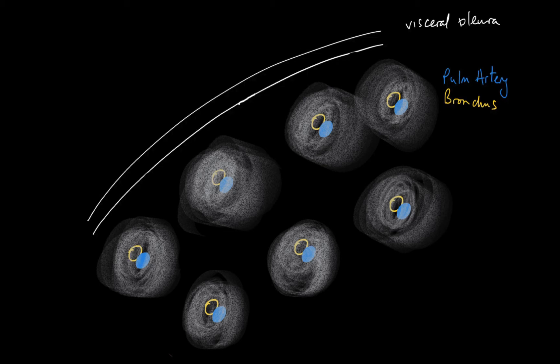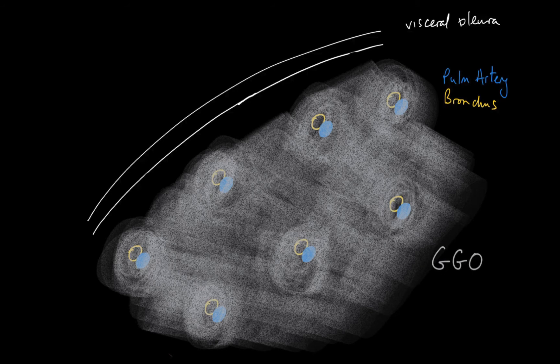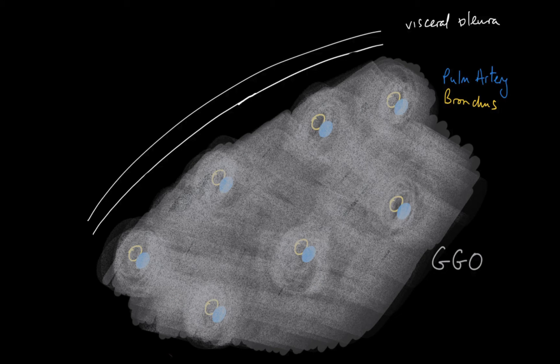As the central lobular nodules get bigger they start to become more ill-defined and start to coalesce with one another pretty much everywhere. The difference between ground glass change and consolidation is: where you are unable to see the blood vessel this becomes consolidation, otherwise you're dealing with ground glass opacification.